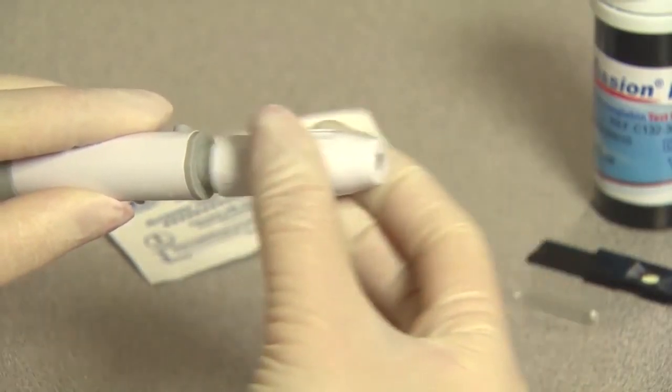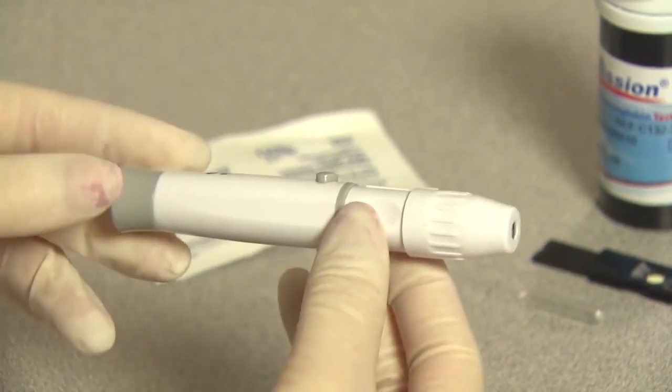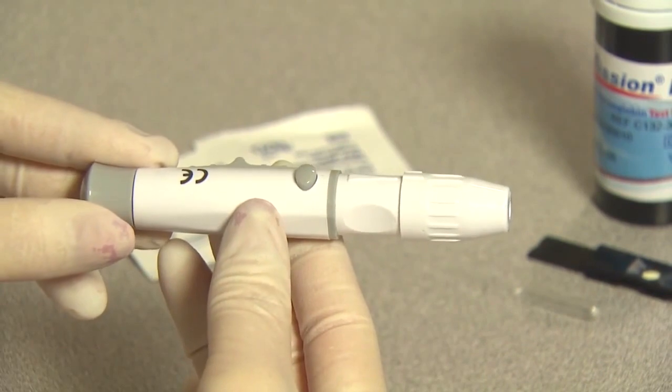Carefully screw the cover back onto the lancing device. Avoid contact with the exposed needle. Make sure the cover is fully seated on the lancing device.